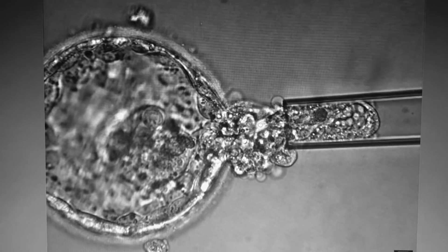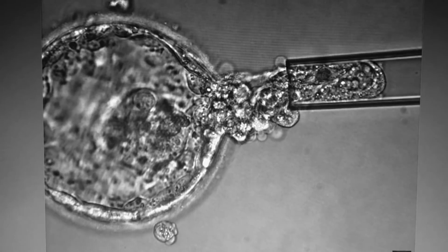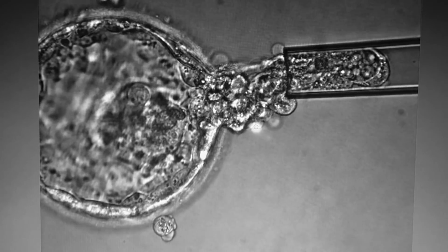As you can see, the laser is now being applied for the final time and the cells are gently being separated away from the rest of the blastocyst.